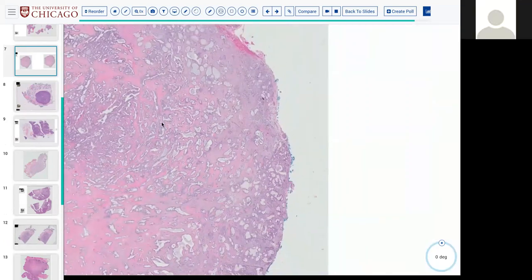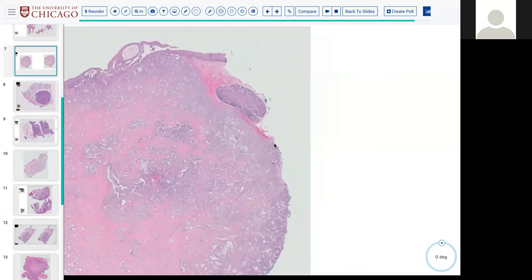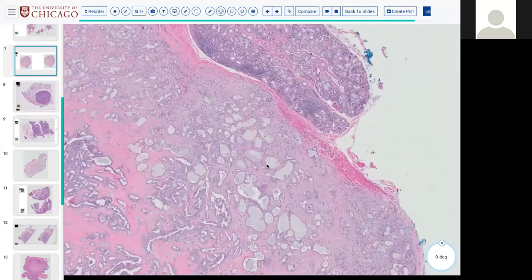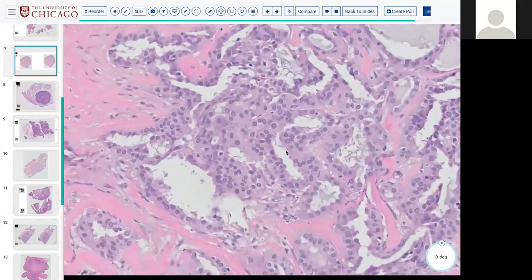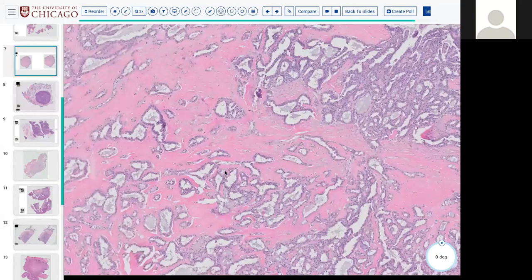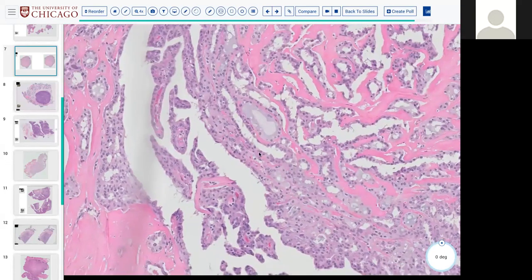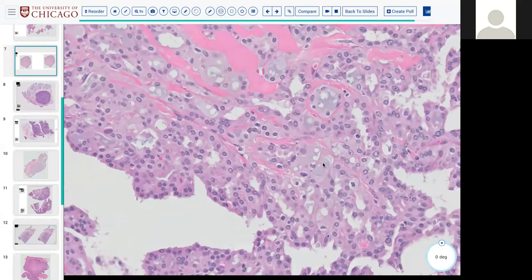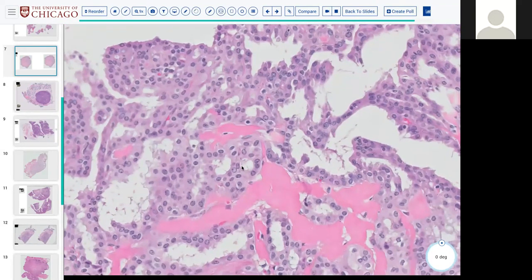I can try. Thanks. So this looks like a very infiltrative, malignant neoplasm, predominantly composed of these tubules and cysts. And there are those three types of cells: I saw mucus cells, squamous cells, and intermediate cells. The background stroma is quite sclerotic and desmoplastic. Those look like mucus cells and squamoid cells, so I thought of mucoepidermal carcinoma. Okay.